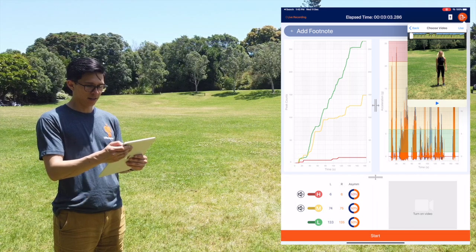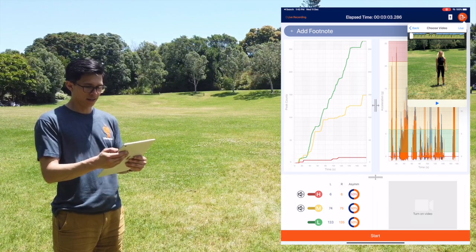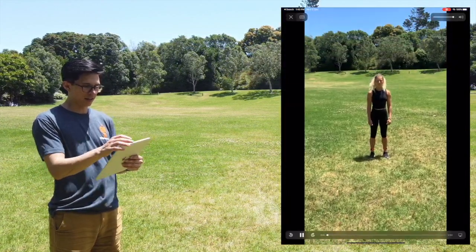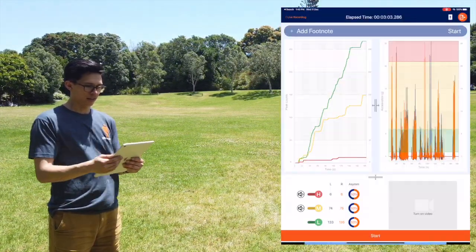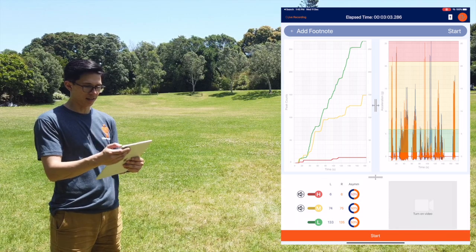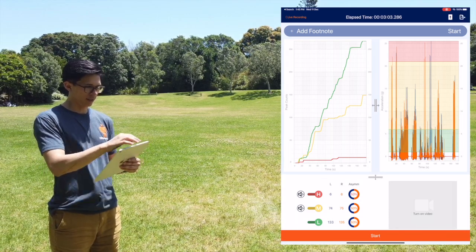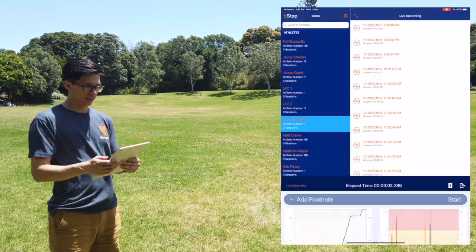To view and playback any video footage you took during the live recording, tap the export icon and select the video you wish to view. These videos are saved to the Photos app on your Apple device.